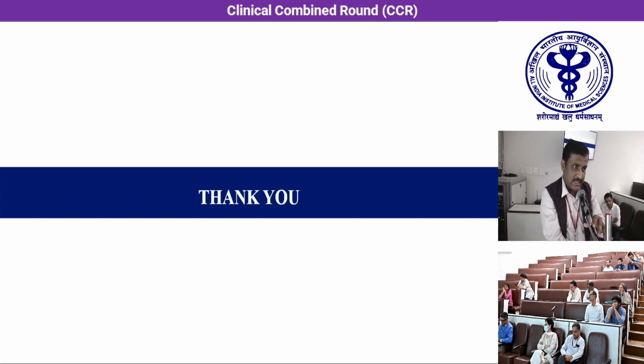And also to give a message, IVC thrombectomy should never be attempted with robot unless you have significant experience of doing challenging surgery and also by open surgery, and your threshold to open up should be very low. You should not persist. If you are finding any difficulty, you should not persist just for the sake of doing it by minimally invasive approach and compromising the patient's safety.